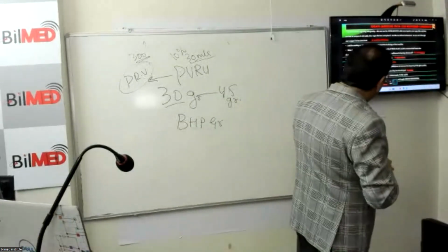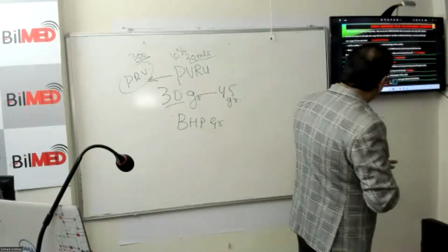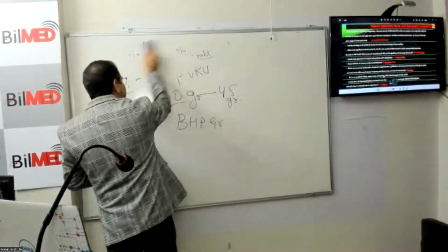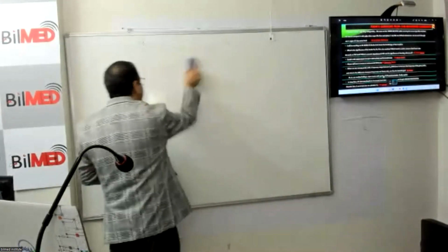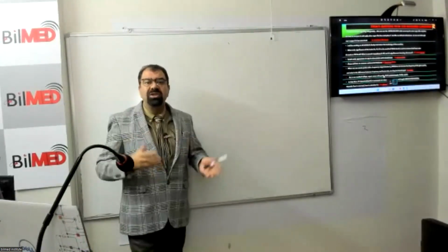Next question from the same doctor, Dr. Abhinash, is that in fatty liver the AP diameter is increased, but what about the length? The point here is that in fatty liver, as we have discussed in the course, more of the increase is in the transverse section. Now the question is, how much is normal?